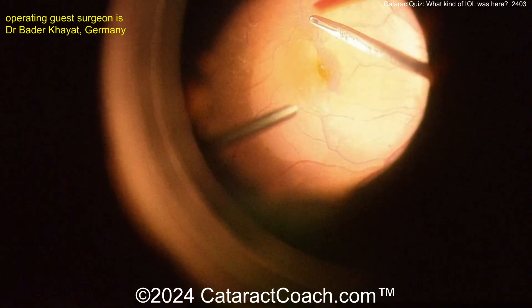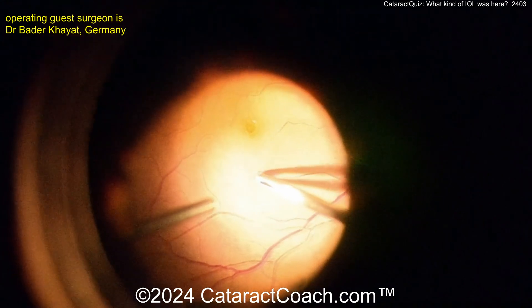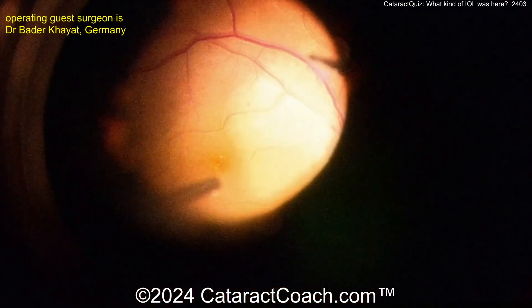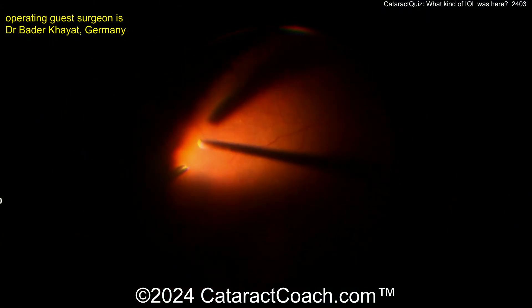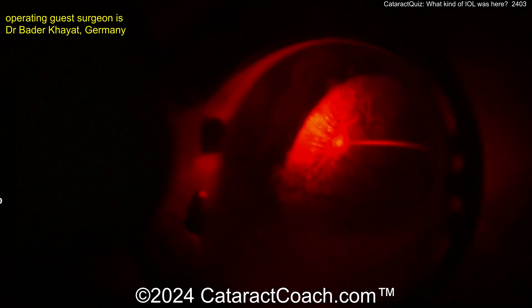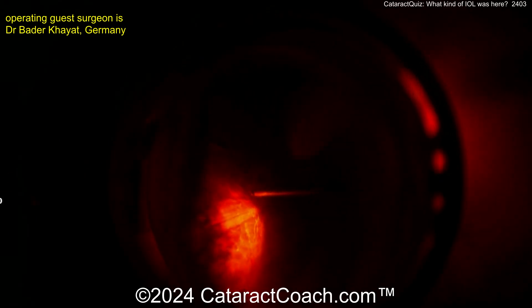Now it looks like a membrane peel is going on — look at that membrane peel here over the macula. That looks pretty good, beautifully done. It kind of always reminds me of a capsulorhexis. Oh, there's a bit of a macular hole there perhaps. And let's take a look — a little laser action going on now. You say, what about retina stuff? Tell us more, Cataract Coach.